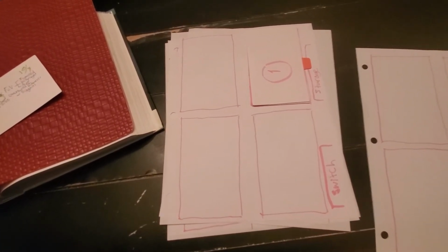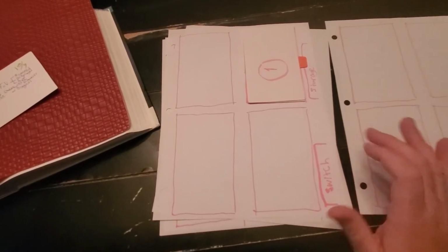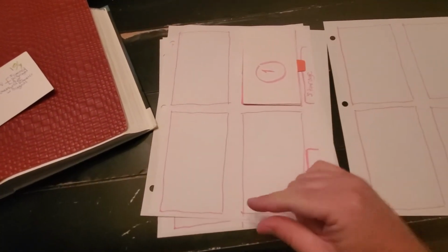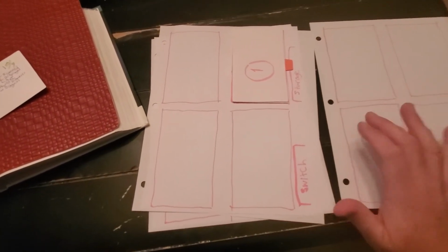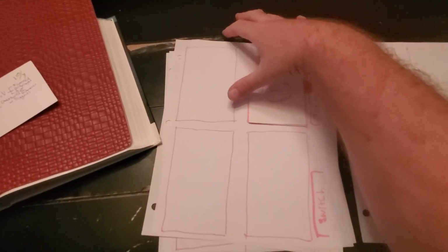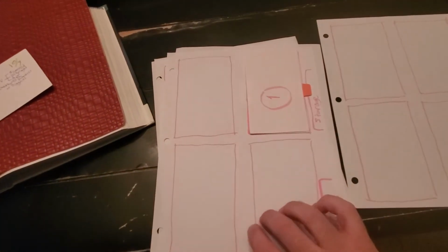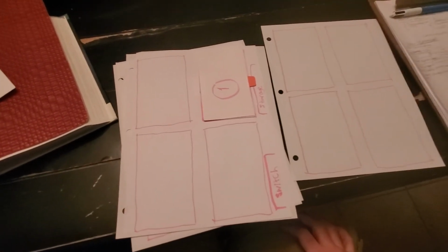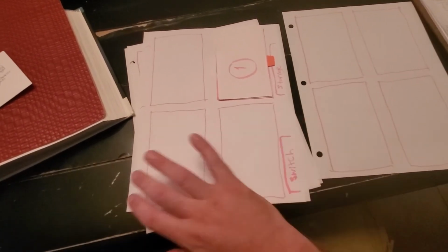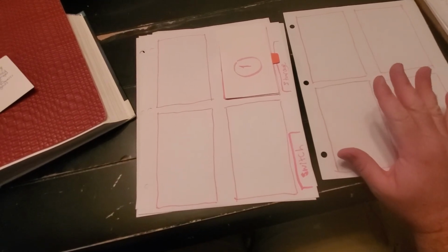And the matrix size is defined by the fill factor times the field of view. So it could be like this, or it could be 4 times the size. What is your field of view? How many pixels are in it? How many of those are active in the field of view?